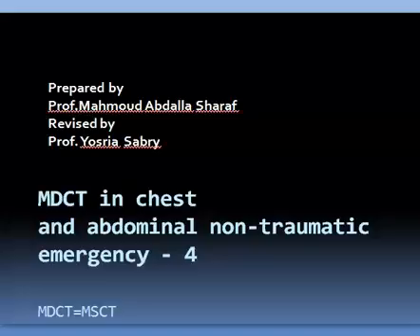This is presentation number 4 in the series on the use of multi-detector CT or multi-slice CT in chest and abdominal emergencies. This one will be concerned with non-traumatic lesions. The previous 3 presentations were concerned with traumatic lesions. It's prepared by Prof. Sharaf and revised by Prof. Yusriya Sabri.